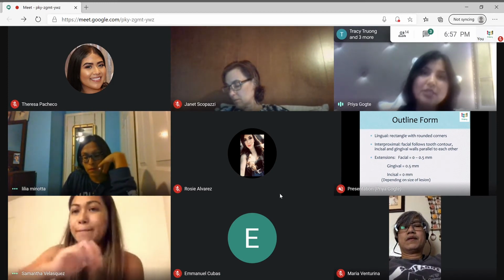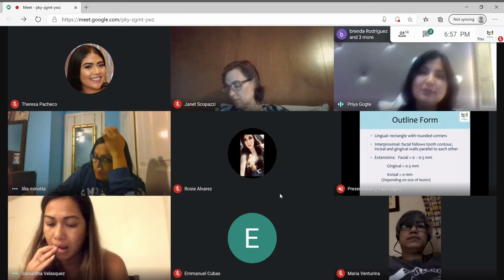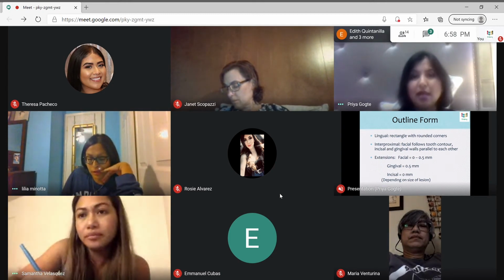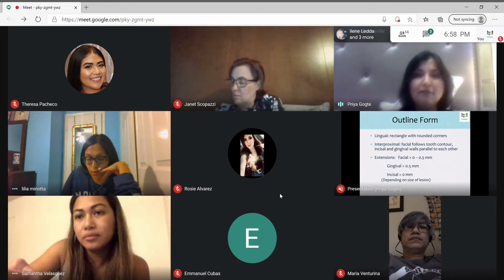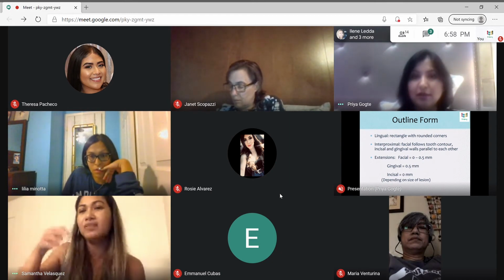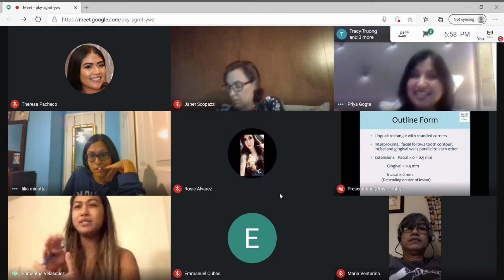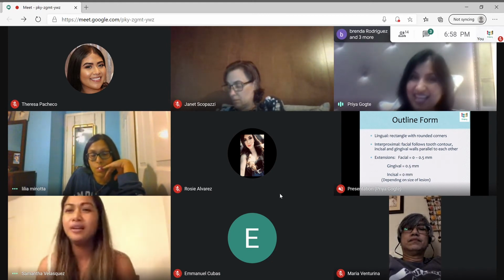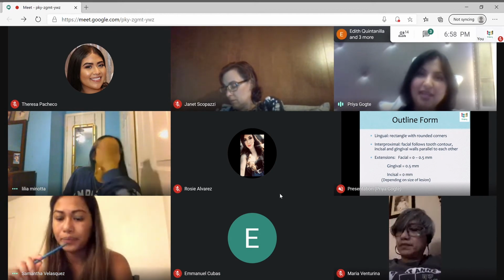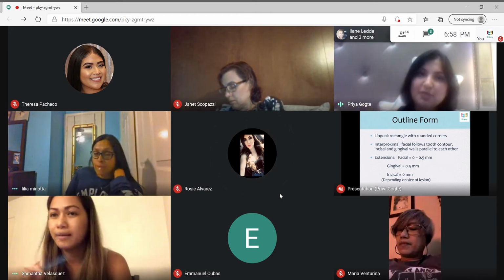And if you watch the YouTube video in my presentation, it explains it pretty well too. Okay. And when you're doing composites, everything has to be rounded corners. That's why concave is inside. Yes, it's inside. That was confusing. I wanted to trick it a little bit. But yes, it's inside where it's concave, but the shape is rectangular.